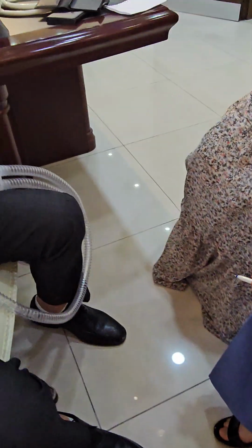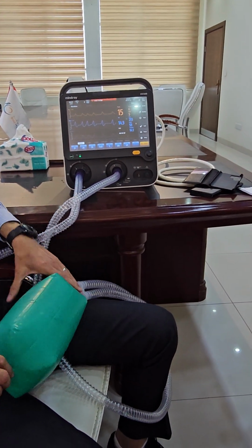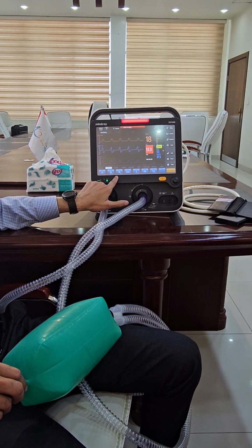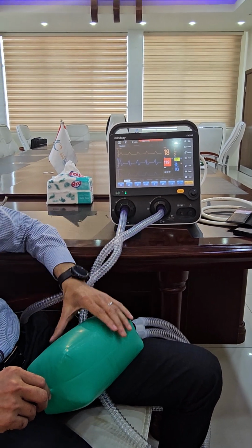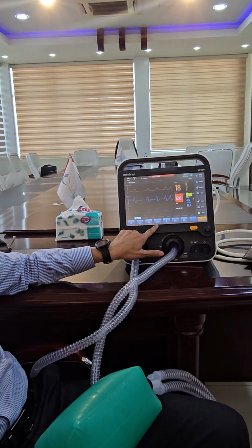It will be safe. Okay? So we cannot give 0.65 inspiratory time and a rate of 35 with an IE of 1 to 2, because there will be no time. So let's say 1 to 1. You understand? So let's say 35 and 1 to 1.